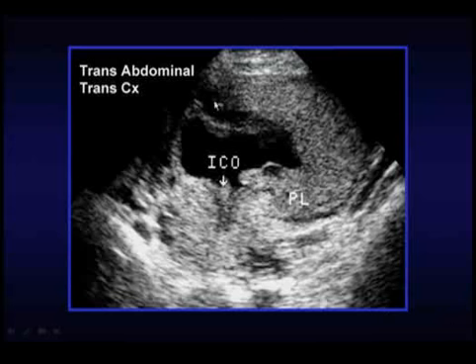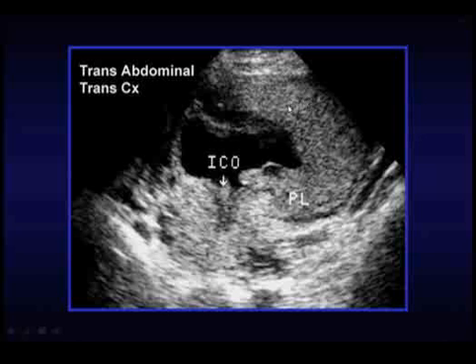Also, from a technical point of view, we talked about the bladder distension. Realize that the cervix itself is almost like, let's say, a roll of paper towels, okay? It has an anterior component, posterior, and two lateral components. That's all the towels against the cylinder of the paper towels, whereas the endocervical canal. And if you were just to do a sagittal scan and you insisted on looking at the midline, you could miss a placenta that's coming in from the side.